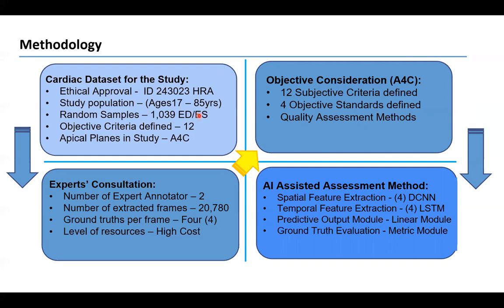The rating is from 1 to 10, with 10 being the best quality and 1 being the poorest quality.